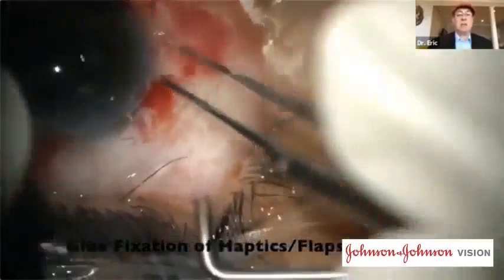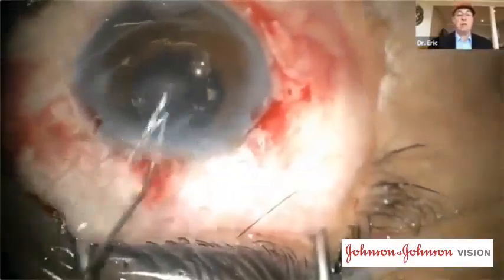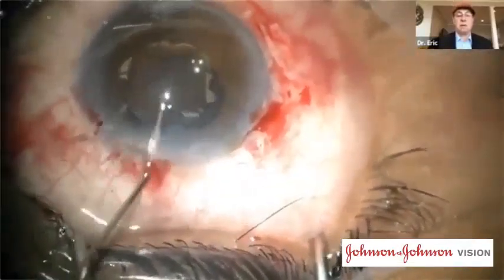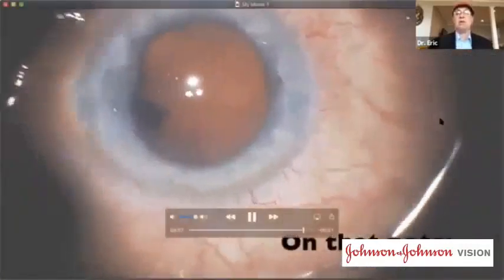The IOL is stable. They tend to last pretty much forever. We've been doing this now for, it seems like, 10 years, and I could not have been more delighted with the results of this technique.